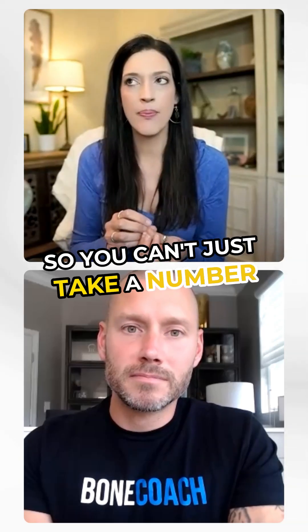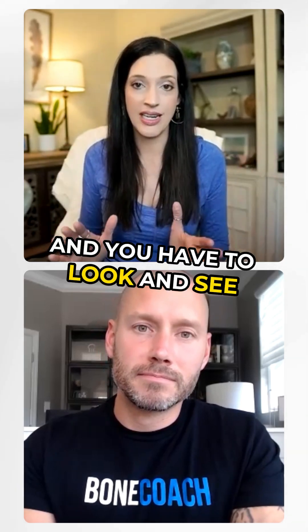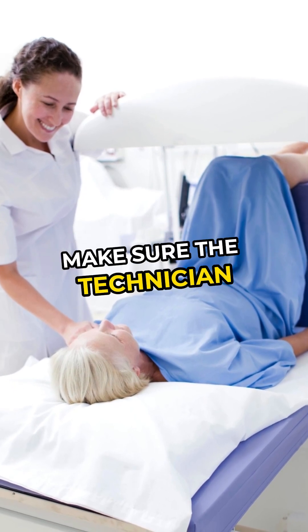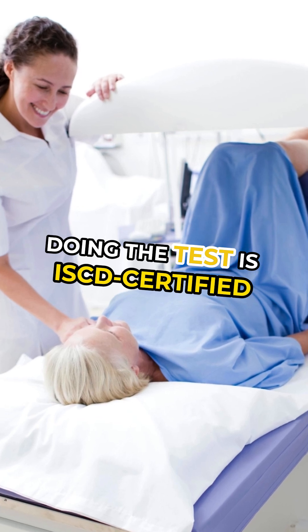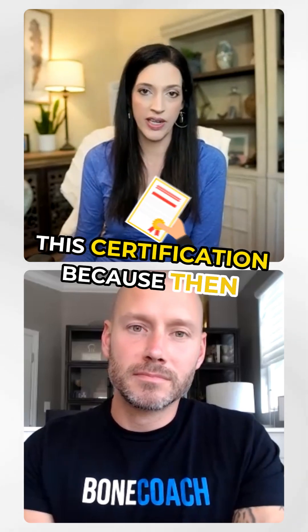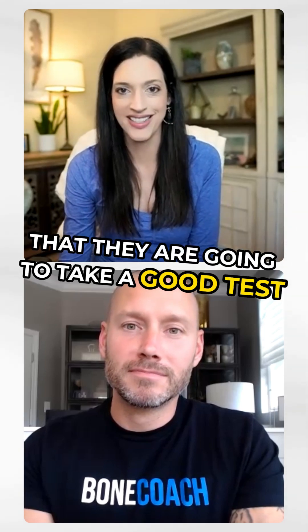You can't just take a number at face value on a bone density test. You have to look at the image and see if the test was done correctly. When getting a bone density test, make sure the technician doing the test is ISCD certified — International Society of Clinical Densitometry — because then you know there's a fighting chance they're going to take a good test.